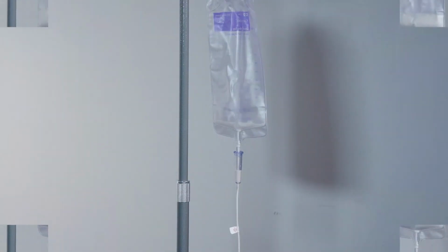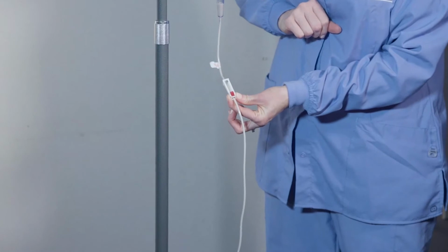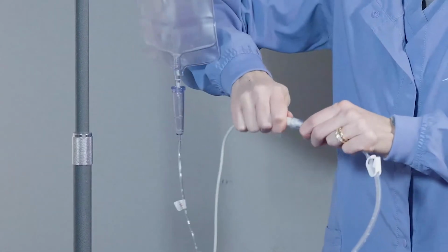When your feeding is complete and all the formula has drained from the bag, close the roller clamp on the tubing. If you are using a valve connector, close the valve. Remove the tubing from your feeding tube.